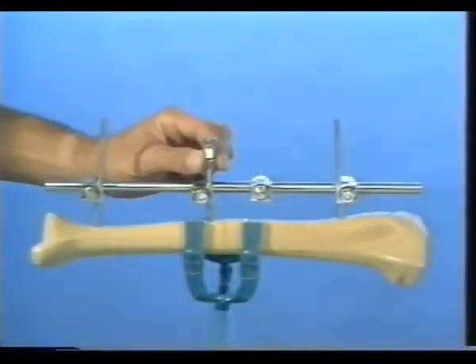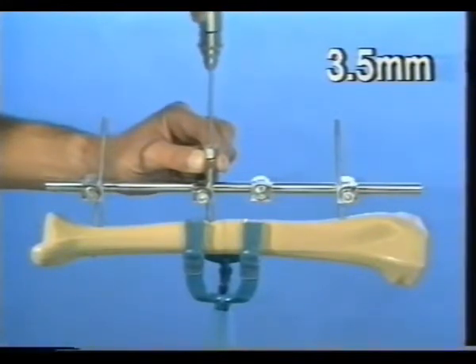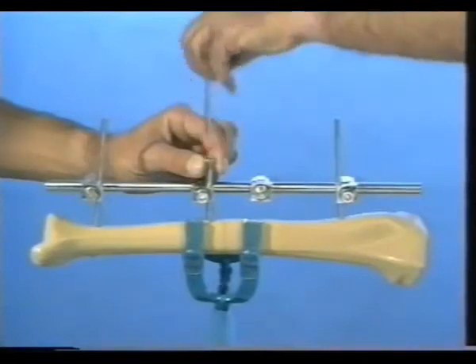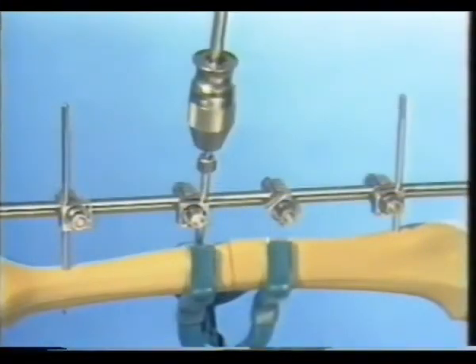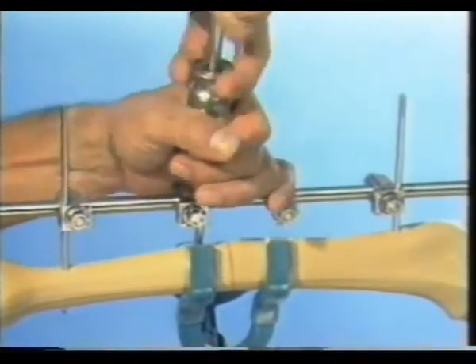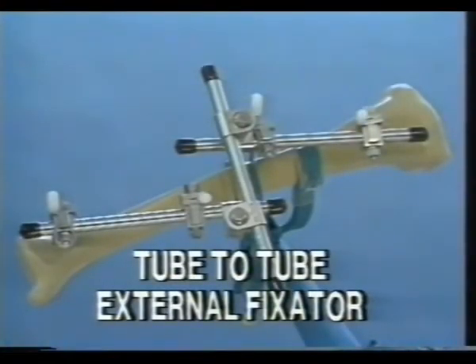Drill the first of the two inner holes through the adjustable clamp using the two drill sleeves and a 3.5 millimeter drill bit. The nearer cortex is over-drilled 4.5 millimeters. Measure the length and introduce a Schantz screw to the appropriate depth. The fourth Schantz screw is inserted to complete the external fixator.